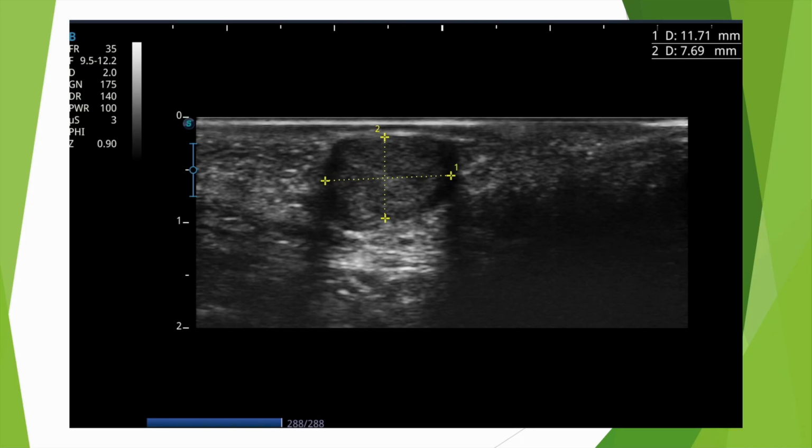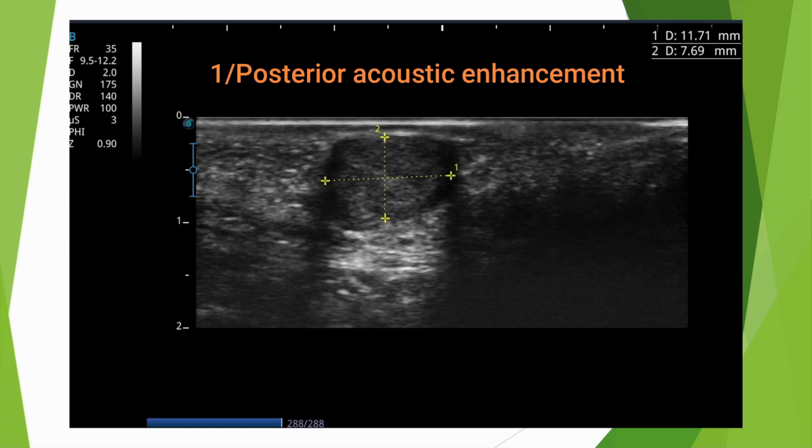They expect that when they place the probe on this image, which clinically is clearly soft and therefore suggests a cyst, they'll see a round anechoic image, meaning fluid filled, but they'll be disappointed because in many people's minds, anything fluid filled appears black on echo map. Actually, that's not the case at all. What should really guide you when it comes to something fluid filled is the posterior enhancement.